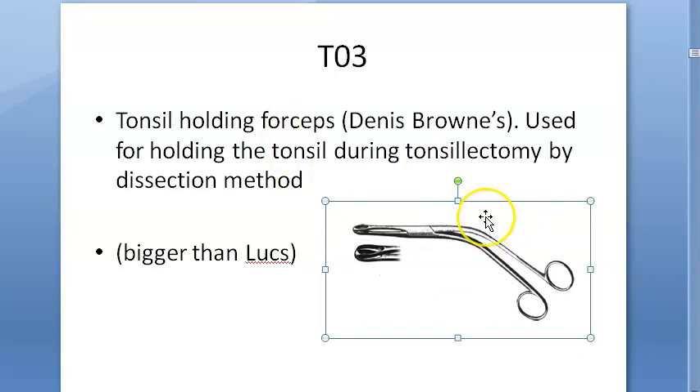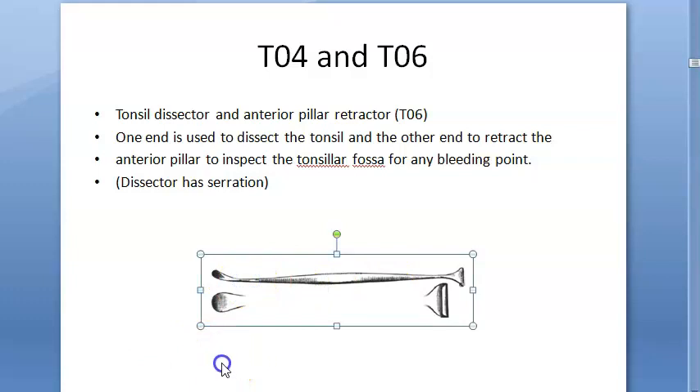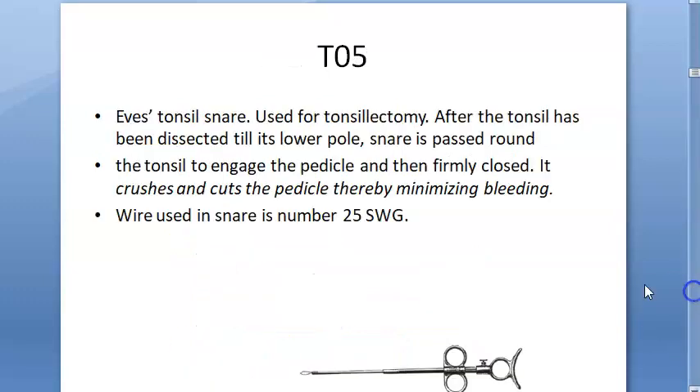Here you have the Denis Browne tonsil holding forceps — this is bigger than your standard Luc's forceps, and it is used to hold the tonsils. Then here you have the tonsil dissector, which is serrated at this end. This is the tonsil dissector, used to dissect the tonsil.